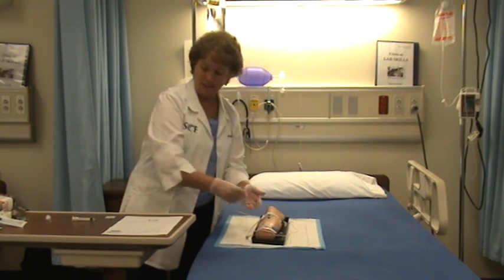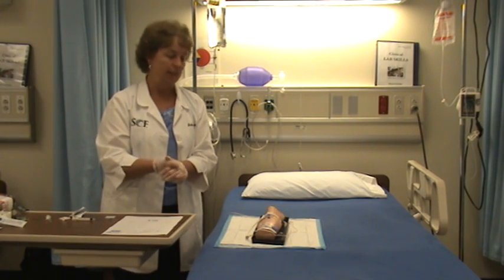And that concludes giving IV push medication to a running IV.